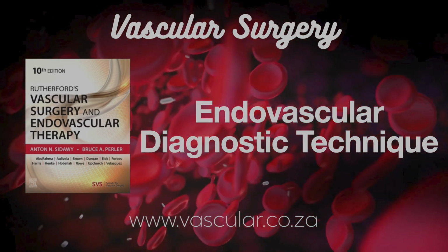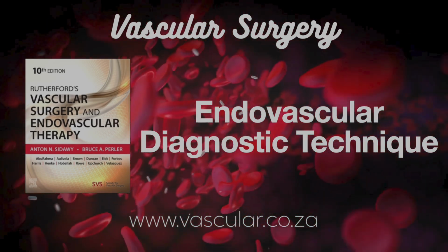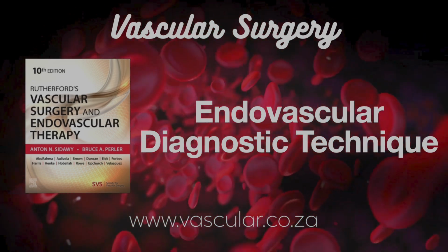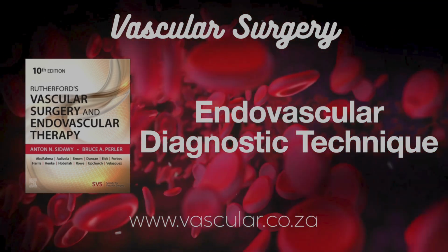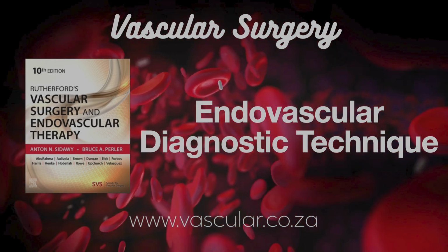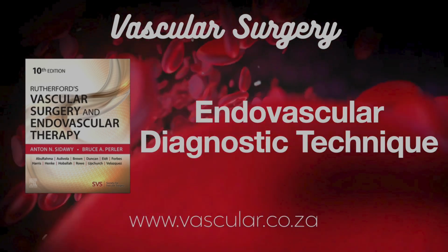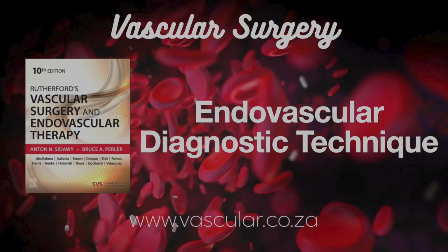Much easier and non-invasive. Okay, the internal jugular vein, the IJV in the neck, big one. Relatively accessible, yeah. Runs between the two heads of the sternocleidomastoid muscle, just lateral to the carotid arteries. Ultrasound needed. It's definitely the standard of care now. Minimizes the risk of hitting the carotid artery by mistake. The IJV can take large sheaths, used a lot for central lines, dialysis catheters, IVC filter retrievals.